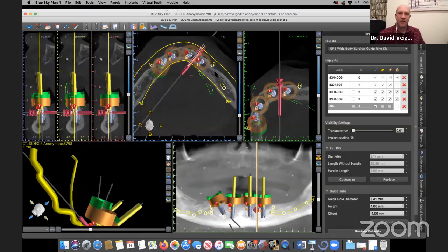So, you mentioned placing radiographic markers on the fitting surface of the denture around the incisive canal in upper sevens and taking a scan in situ. I do it only on the non-fitting surface, just on the outside surface. So I put them on the buccal flanges of the 6, 4, 2, 2, 4, 6, and then on the palatal surface, not on the fitting surface, 7, incisive, midline 7.